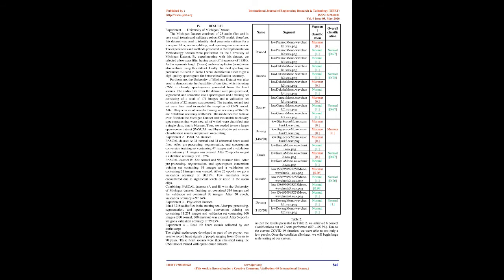As per the user interface shown in Fig 11, the mobile application users, amateur health workers in rural areas, are required to download the application first and then use our low-cost digital stethoscope to record the patient's heart sounds. These heart sounds are stored as a .wav file on the mobile device as well as the AWS S3 storage.